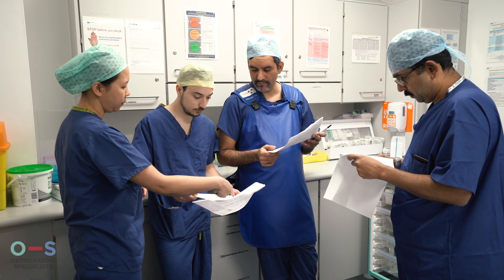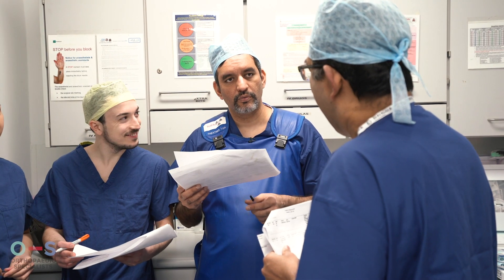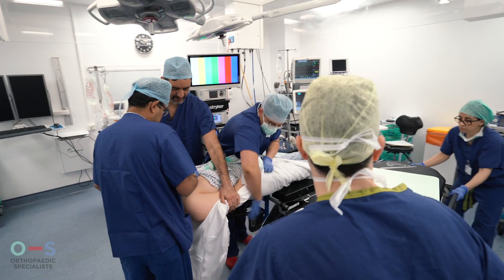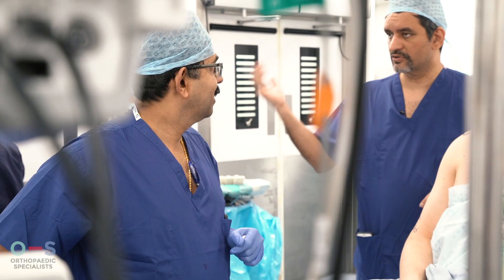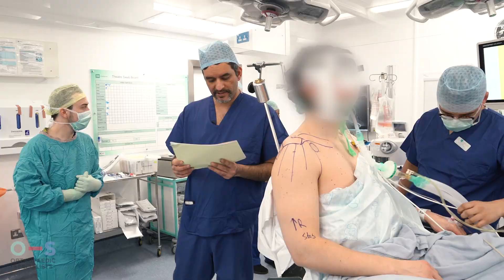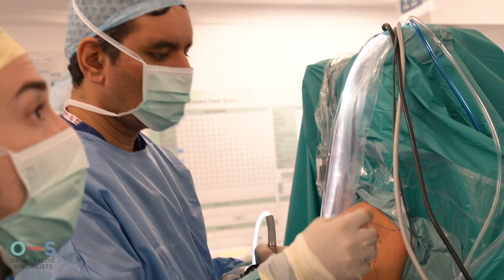Once the patient is consented, we carry out a team brief where we discuss all the patients that we are going to operate on. This consists of confirming the plan for the day and any concerns the surgical team and the anesthetic team may have. Following this, the anesthetized patient is transferred to the theatre and positioned safely on the operating table. Once we have safely positioned the patient, we do our final confirmation called the WHO check. I scrub and then we prep and drape the patient and then start the procedure.